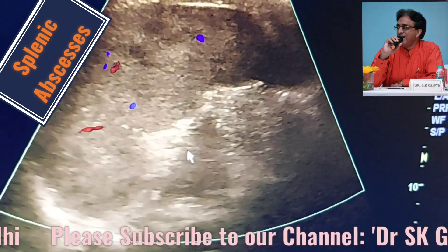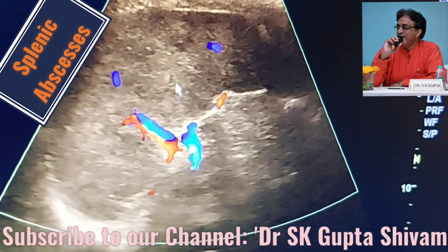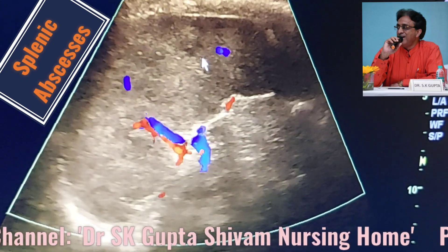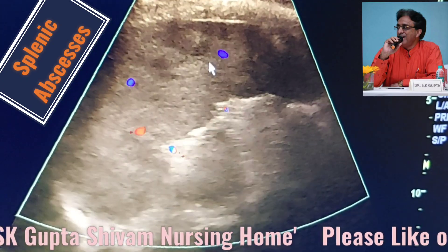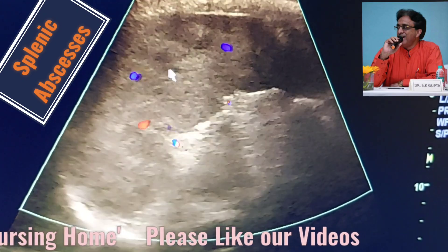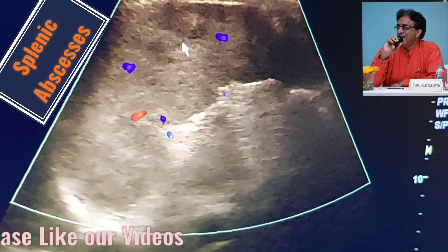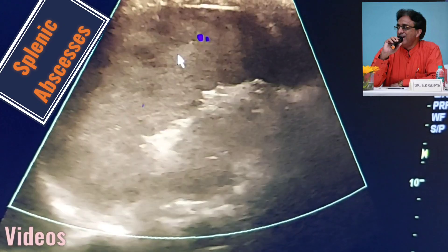Sometimes it gives rise to confusion whether these are abscesses or blood vessels, but the blood vessels are outlined by the color Doppler scan while the abscesses remain without color uptake — so these are confirmed to be splenic abscesses.